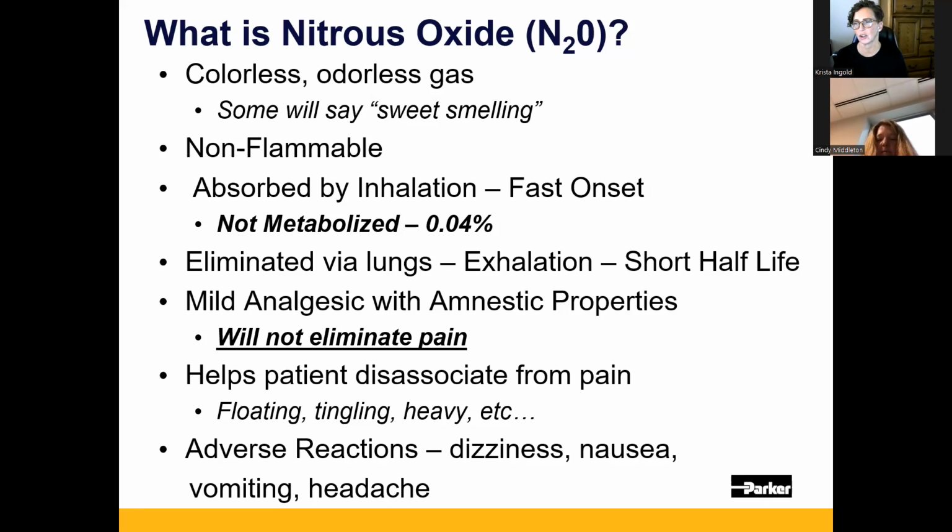As the contractions get closer and closer together, you can encourage her to breathe it between the contractions. She builds it up in her system as she's resting. And then once that contraction hits, she could just set it aside and focus on getting through that contraction, okay? Or if she's pushing, same thing. Builds it up during her rest period, sets it aside, bears down, and pushes, okay? So in order to get the best benefit, your goal is to be a couple of minutes in at peak benefit at the peak of the contractions, and that's part of coaching. Once she gets the hang of it, she'll have the hang of it. It won't take a whole ton, and she'll know when she has waited too long to put it up there as well.